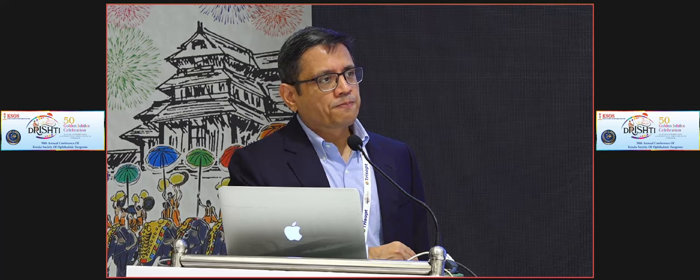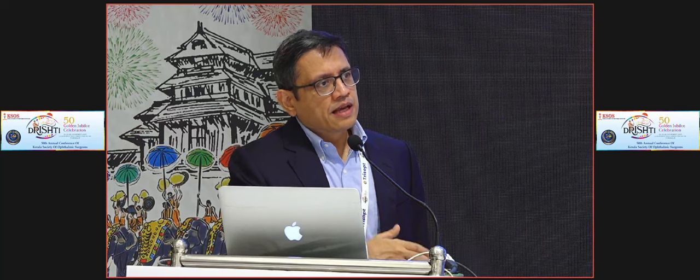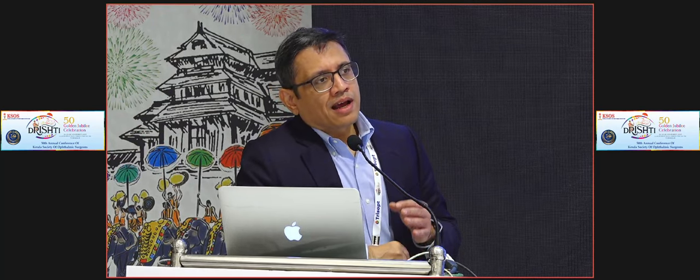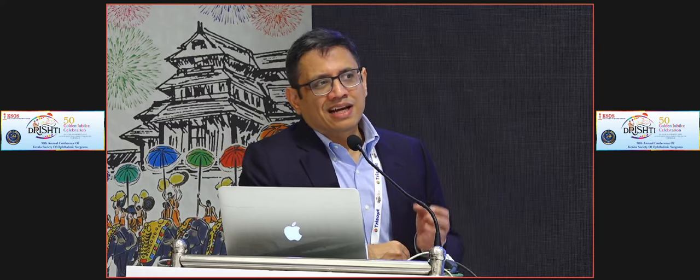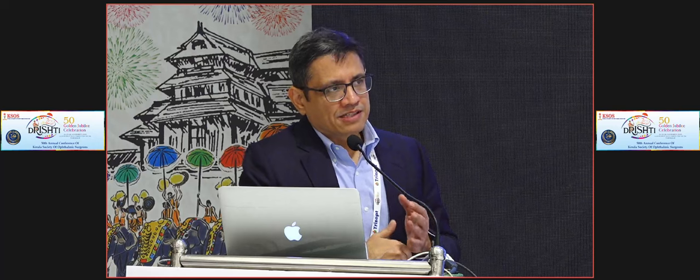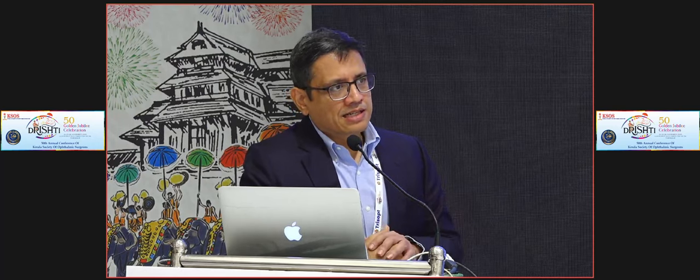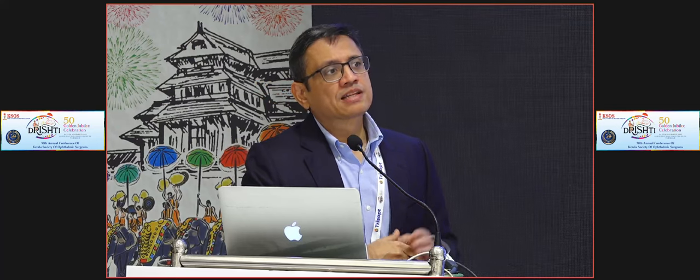Especially, even if you have both choices, I think there is still a smaller subgroup where these lenses are not feasible 100%. Like I said, when the pupil is very small, IFIS type of cases, under topical anesthesia, it's not possible to retract the iris. So in those iffy type of cases also, I think it's a good choice if the astigmatism is up to 1 diopter, rather than a monofocal.